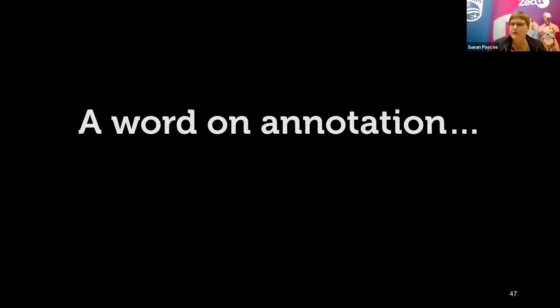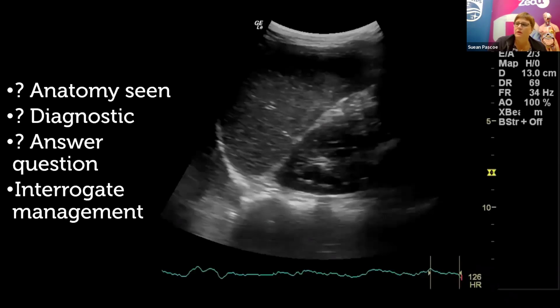So these images that we're looking at of the liver here before, I'm assuming it's liver, it might in fact be spleen. There's nothing here to indicate is that the right side or the left side. Now, I personally have had a FAST scan. The doctor got the answer right. I managed to get to say thank you to her at the conference in Tasmania last year, Brian. She remembered my case, but probably because there was a sonographer watching her, I think she was really quite nervous about it. But also, I asked her for the pictures after it.